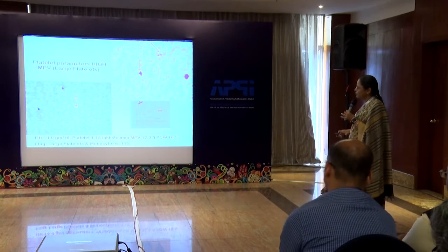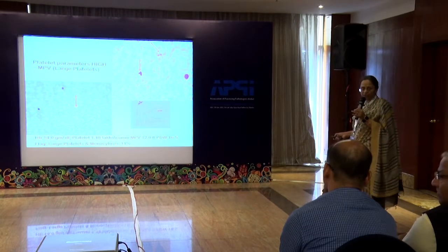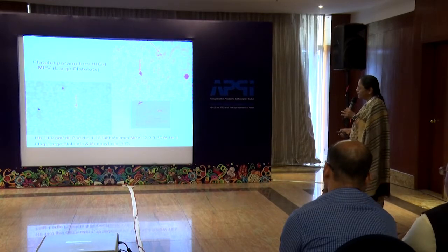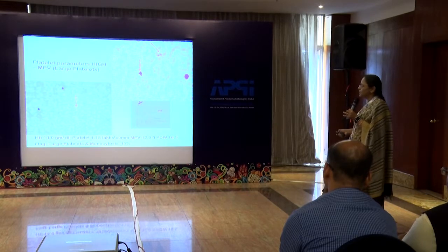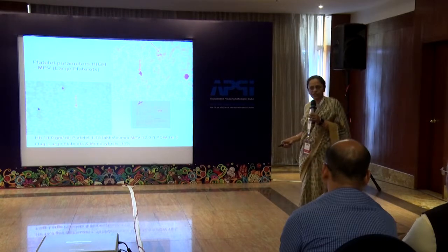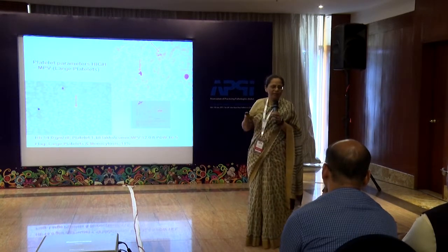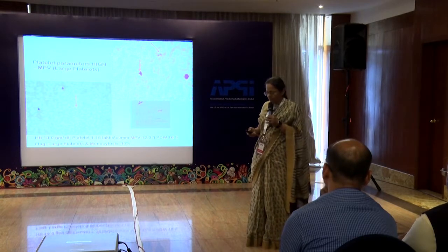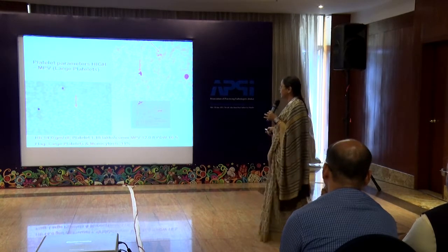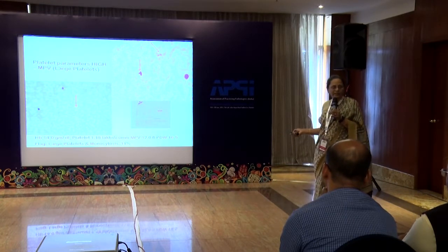And then you have a neutrophil, or I don't know what, it's dysplastic. So there are giant platelets, and there is a monocyte. So if the clinician didn't give you the history, you could ask and you would find that it would be an elderly individual with dysplastic platelets, dysplastic granulocyte, and a monocyte.